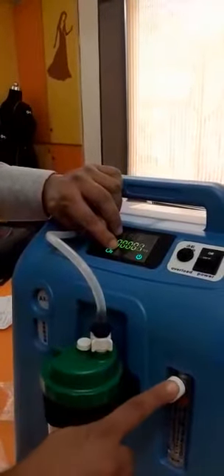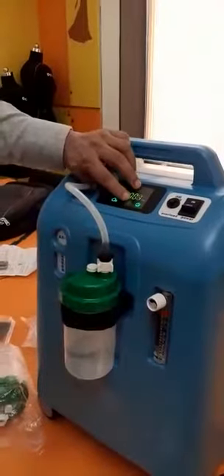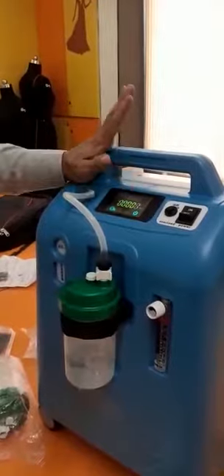A yellow light most probably means you haven't turned on the knob, or there is an obstruction somewhere. The third indicator is a red light with a spanner symbol, which means the machine needs servicing.